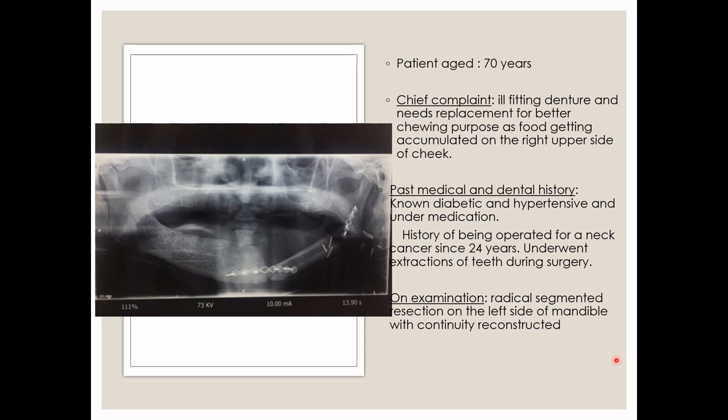Here the fibula is placed along the inferior border of the mandible to improve the mandibular contour, and so we may go with an elongated dental prosthesis, which results in unfavorably excessive lever arm forces.